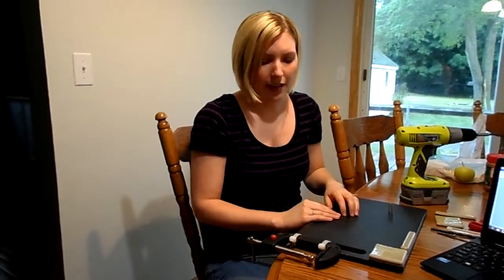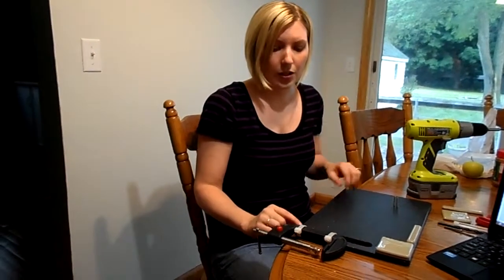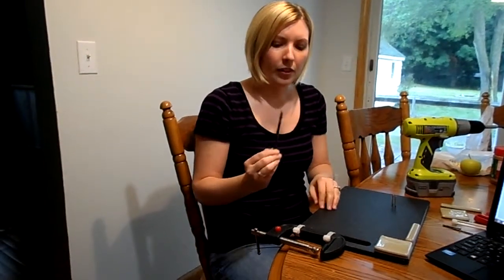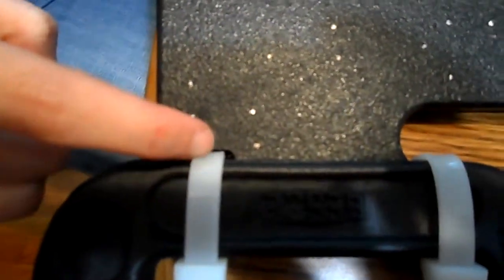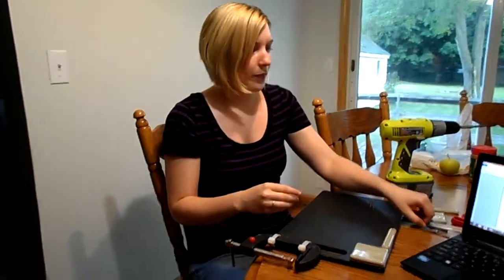Once you have done that, the clamp will be secure, but you want to make it a little bit more secure. So you're going to take your 1/4 inch drill bit and drill a hole directly below the clamp in the lower right corner. So you would take your drill bit and drill a hole right here, as you see I've done. That will allow for the second zip tie to go through the hole.